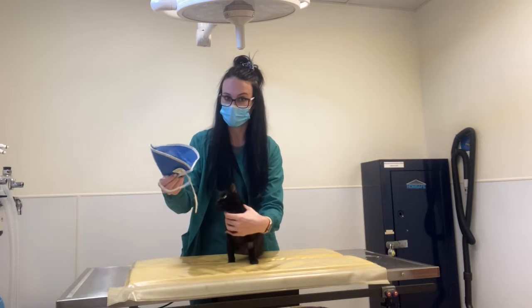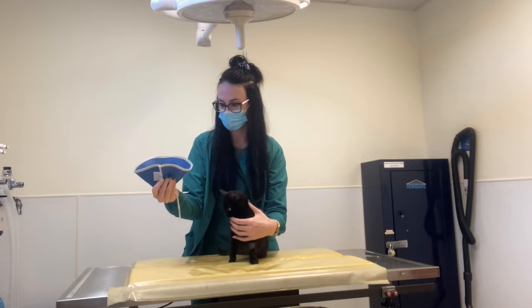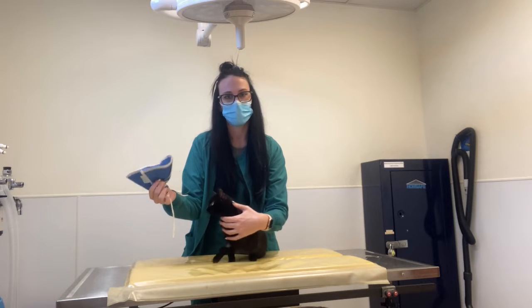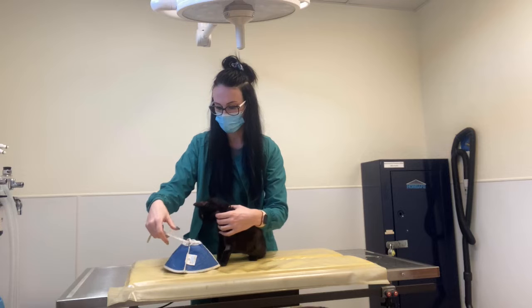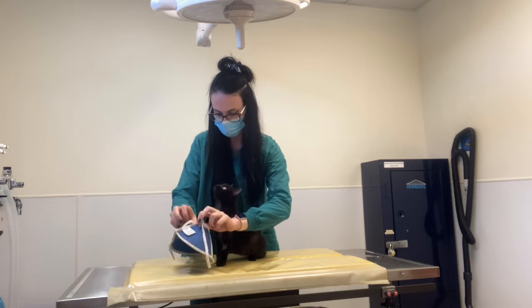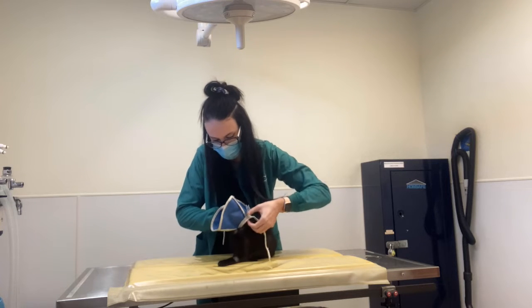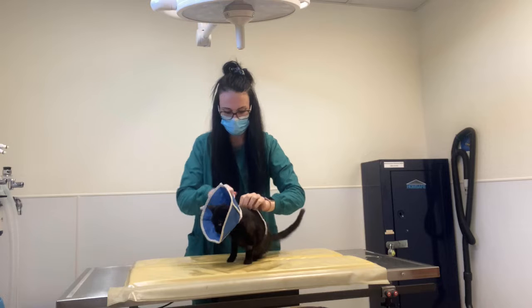So these are our cat e-collars. We don't have to put these ones together. They already come together, and they're kind of like a thick, plasticky material, and they already have ties on them. So in order to put an e-collar on, we're just gonna hold her head. I know, we hate the e-collar. And we're just gonna slip that over like that.